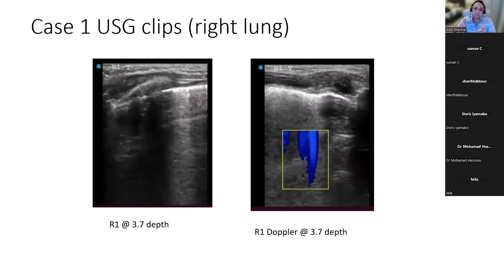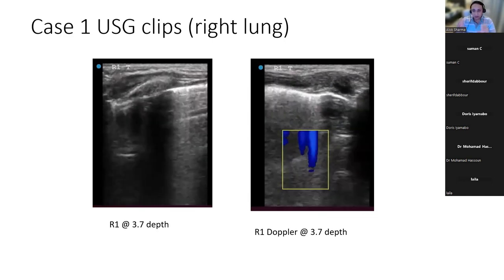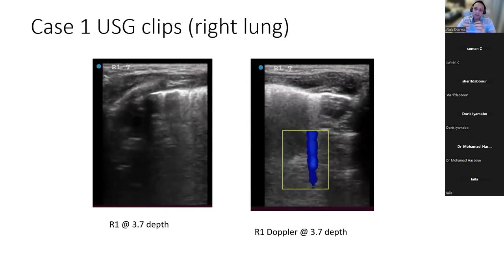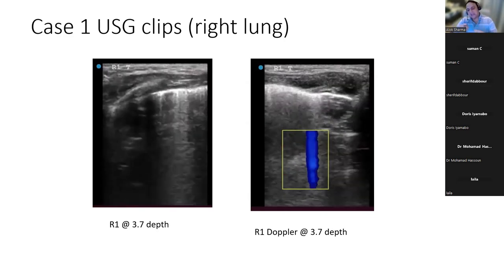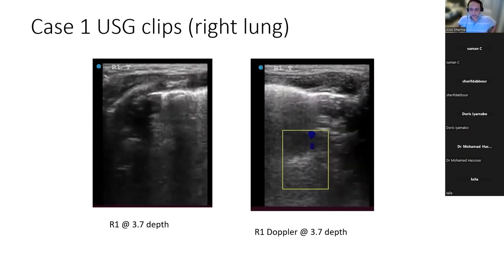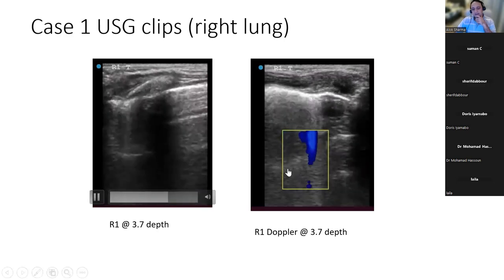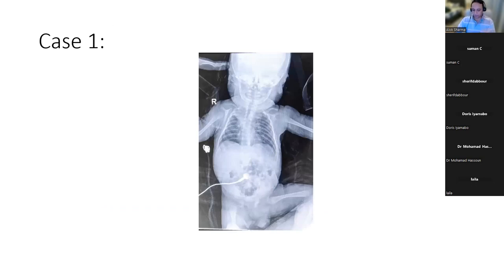It's also a good example of how the thymus can cause confusion, because we're going to discuss this in great detail on Thursday, and I'm going to get you to understand when the thymus can be really confusing, especially on that right side. But well done. I know you've got one more case, Suman. Can we do it next time so that I can get one more person to present today? Not an issue.